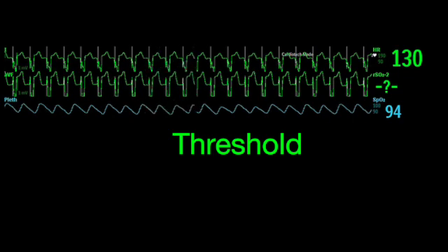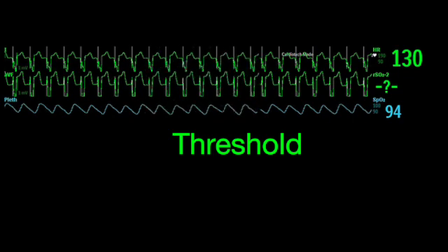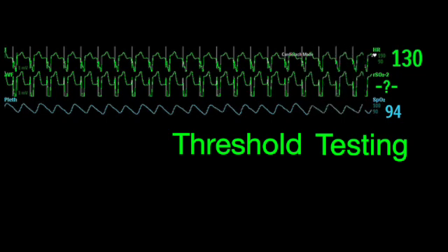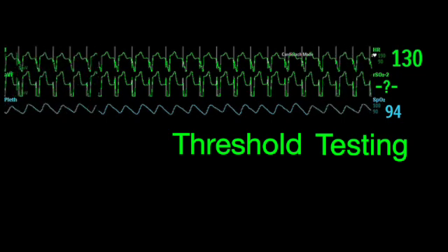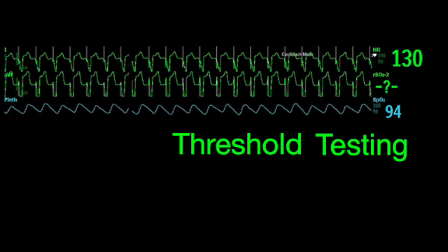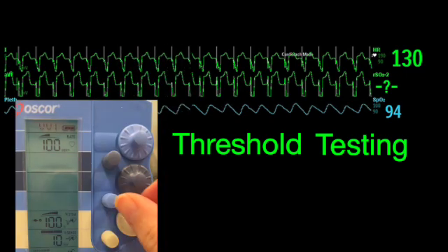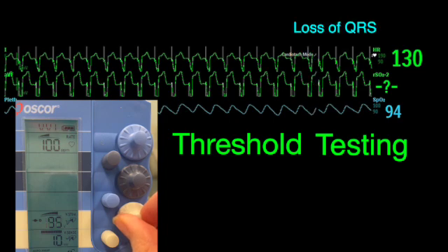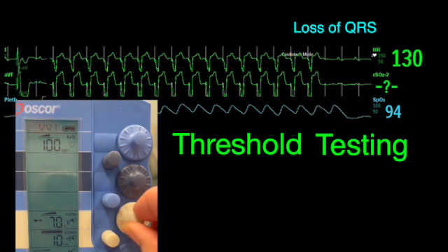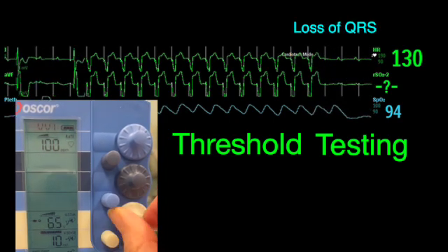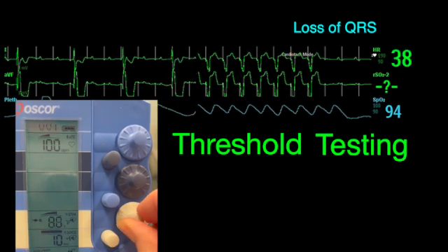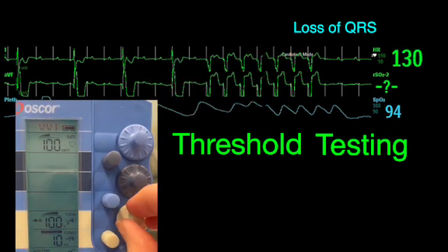To determine what to set the output at, we need to figure out the pacemaker threshold. Threshold is the minimum current needed to capture the myocardium. Threshold testing should be done daily if the patient is pacing, because this number will change over time. To test the capture threshold, slowly turn down the output while closely watching the monitor. When you see the pacing spikes but no following P wave or QRS, that is the threshold.